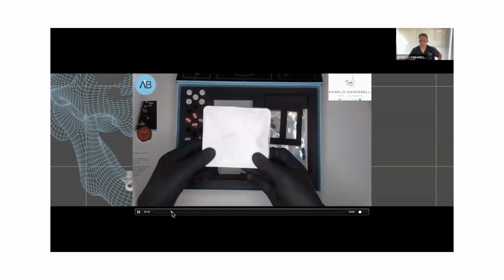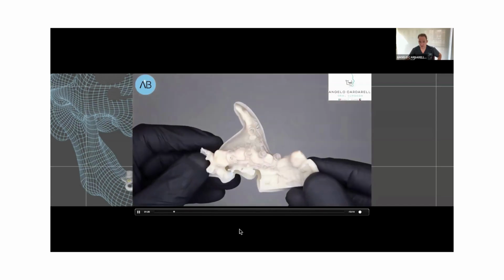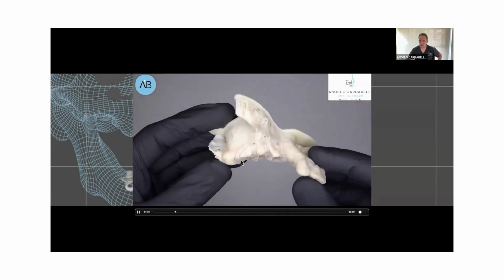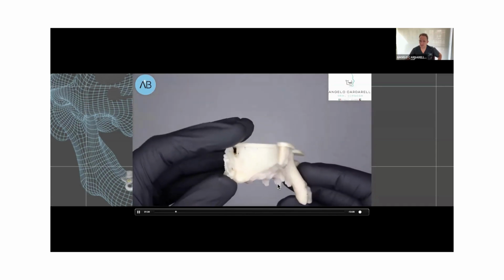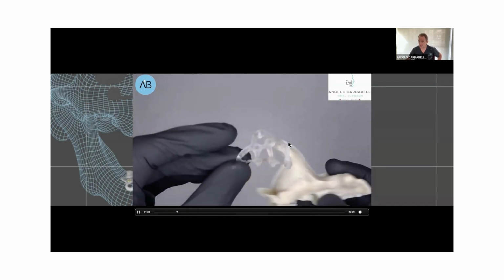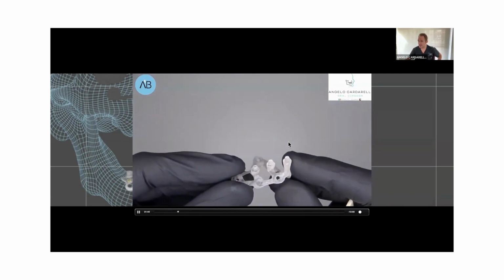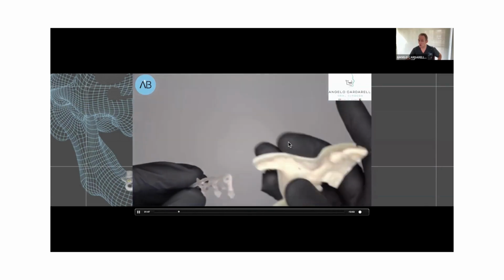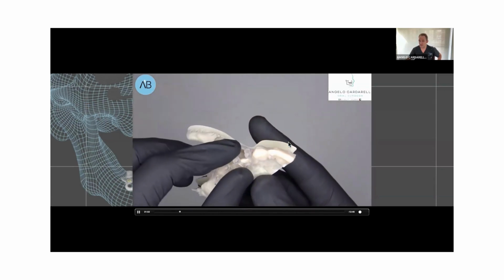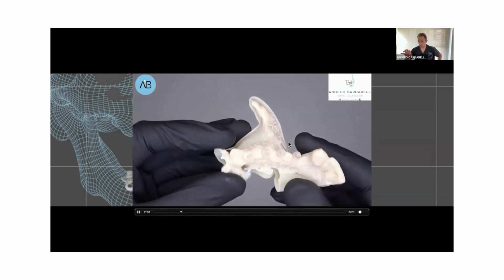And then we have, I will be quicker, the 3D printing model. Again, you can see here this plastic guide and how we can use the plastic guide. For example, I'm using this plastic guide before placing the titanium customized implant. Why? In order to understand if our flap is enough in terms of the extension, and also in order to understand if this customized implant is precise in terms of the fitting on the bone.